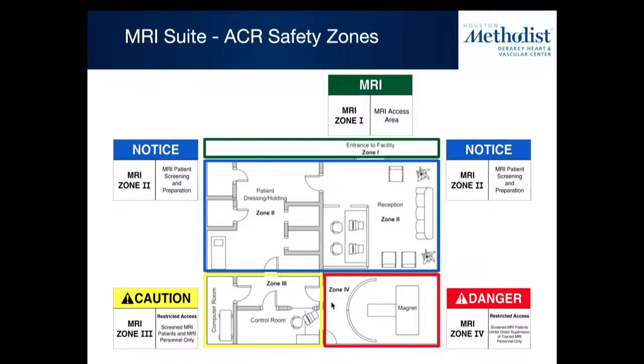And then these areas are all access controlled as well. So you usually have to have a badge or a keypad. It's not just wide open, okay? Nobody can just automatically go in and out, because you don't want somebody just drifting in from the street into a zone 3 or zone 4, okay? Because your MRI facility will be closed down if that happens.